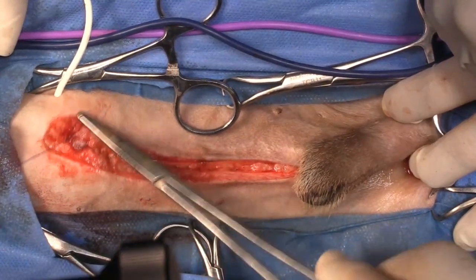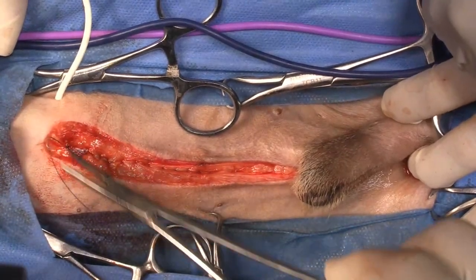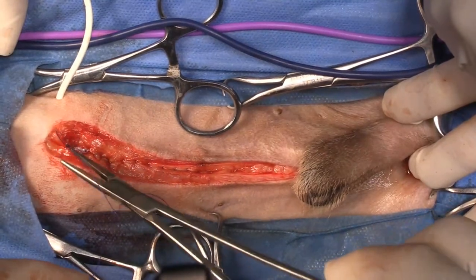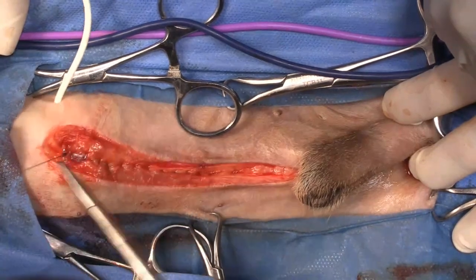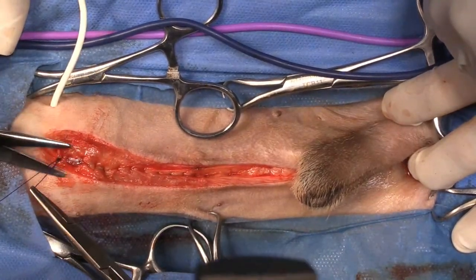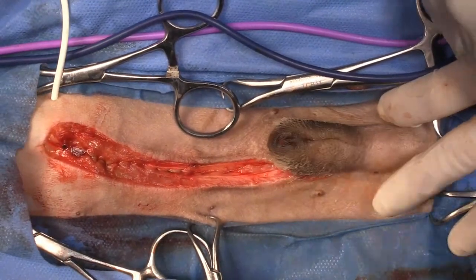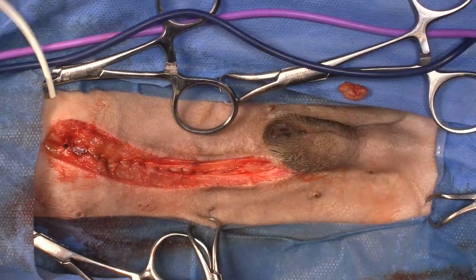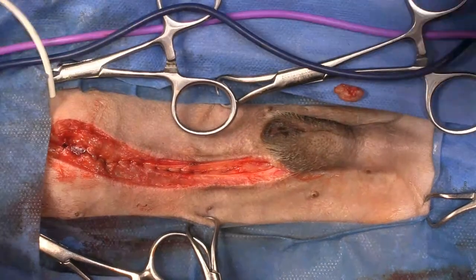And so again, if I didn't have a ventilator and I created that hole, I might be more likely to try to fix it straight away, put in a chest tube and fix it straight away rather than waiting till the end of the surgery like we did. The reason why I waited to the end of the surgery is because making a fenestration in the diaphragm is actually a good way to get the liver to drop caudally, making it easier to assess and manipulate the liver.